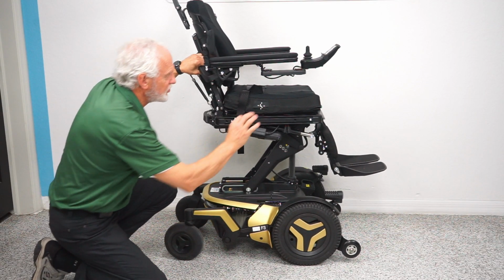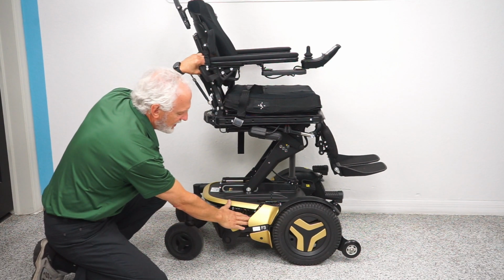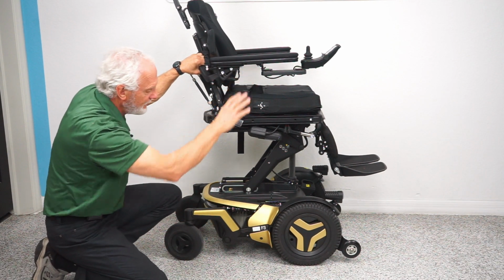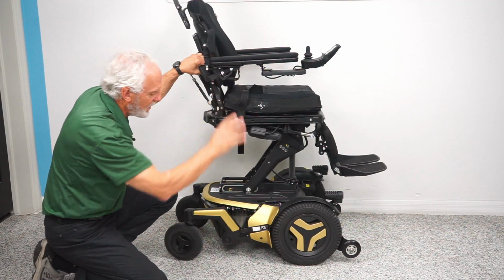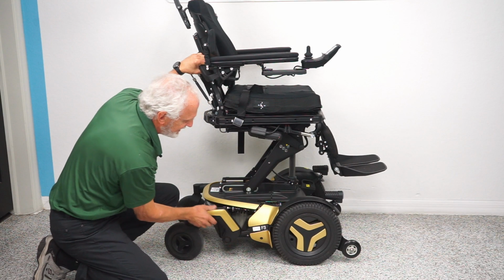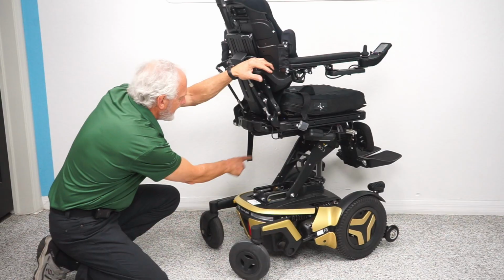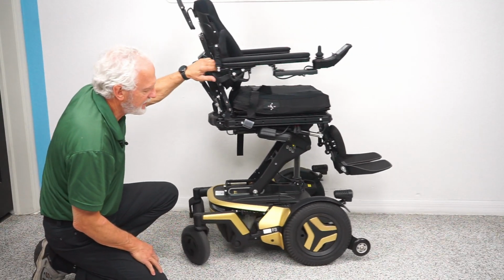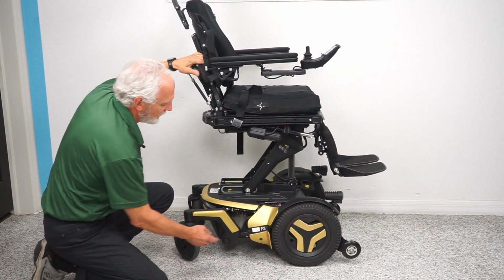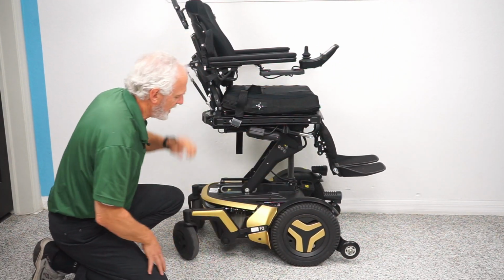So to put it in neutral, you want to turn the power off. And the reason you want the power off, these are electric motors. So no power, even though you're not going, turn the power off. And this little handle here, that's your neutral. Look, if I push it down, look at that. It frees up the wheel. You have to do both motors on both sides, and you can roll the chair fairly easy, okay? When you're done, put it back in gear, turn your power back on.